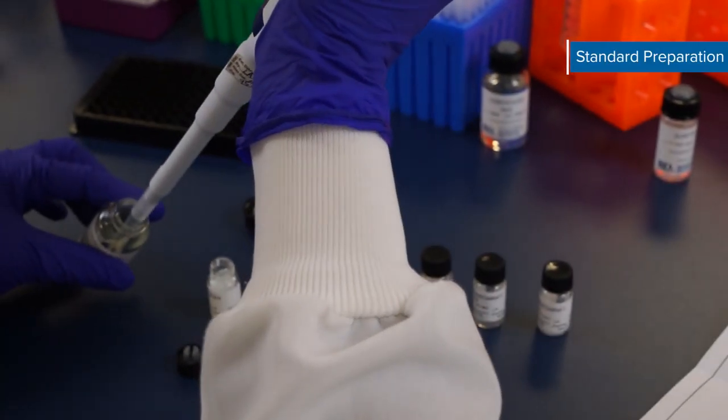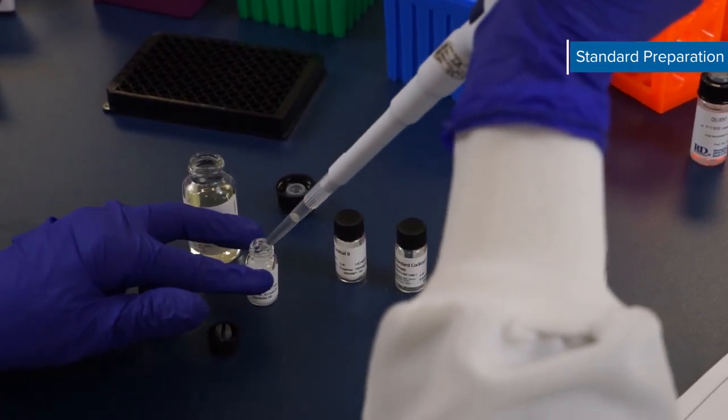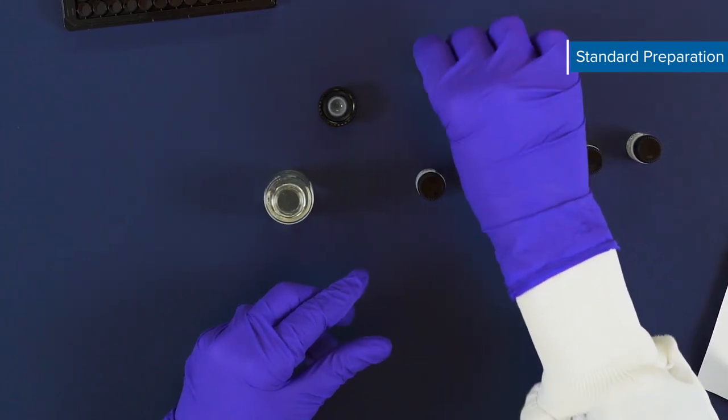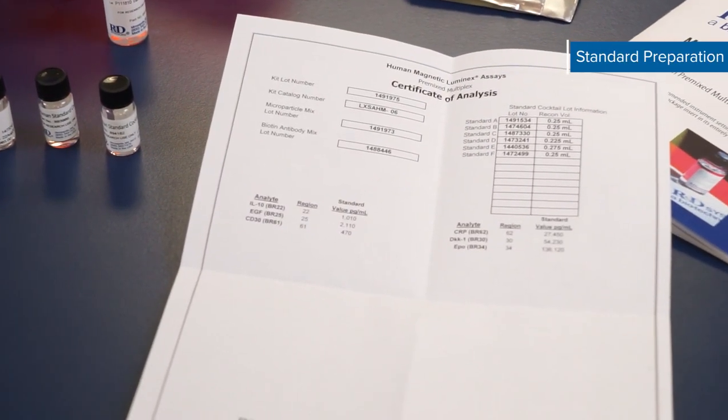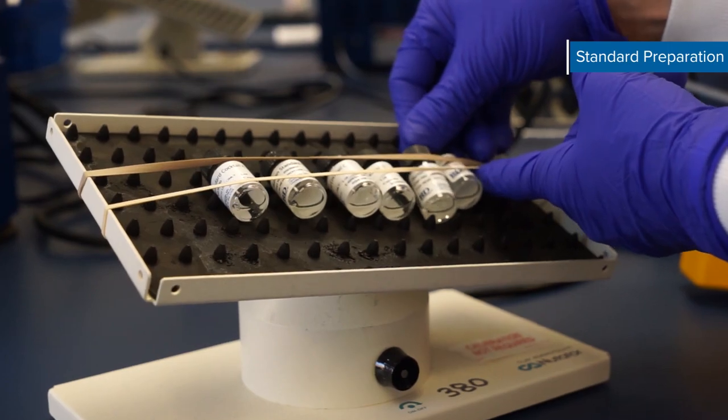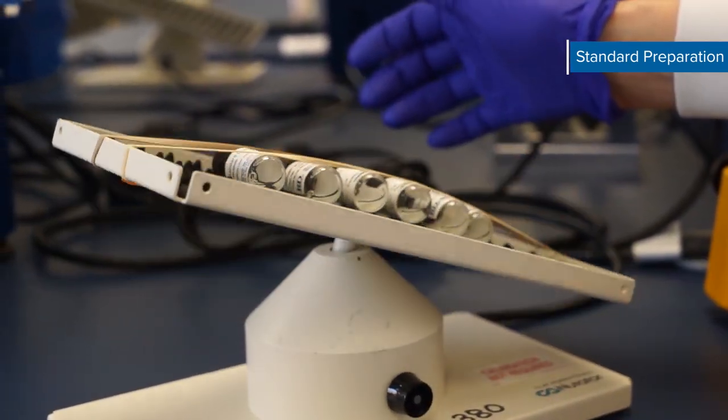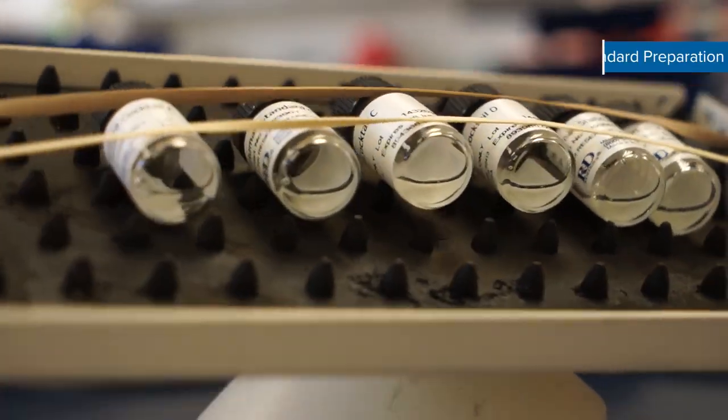The standards in your kit will differ depending on the analytes selected. Reconstitute each of the unique standard cocktails with the calibrator diluent provided in the kit. Refer to the certificate of analysis for reconstitution volumes. Allow the standard to sit a minimum of 15 minutes with gentle agitation prior to making dilutions. Do not vortex these standards.